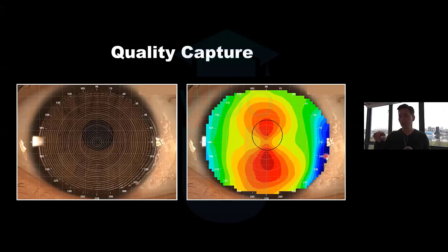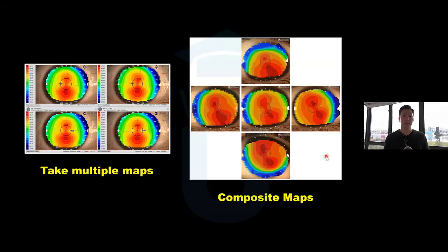Each one of those contours is very well rounded. You don't see any sharp points. You don't see a sudden island next to a sudden depression. I believe this is an accurate map because it looks so smooth to me. But I'm never 100% sure.